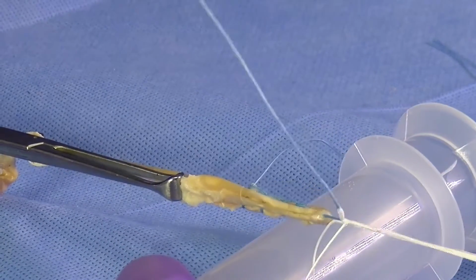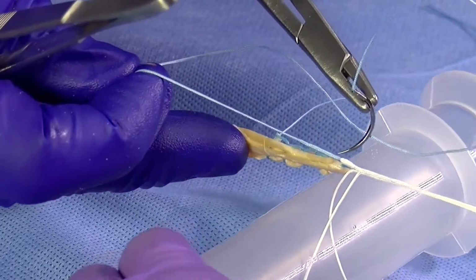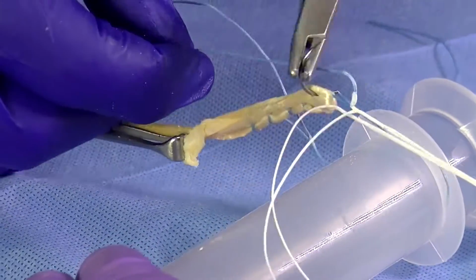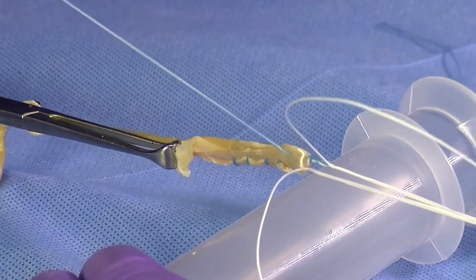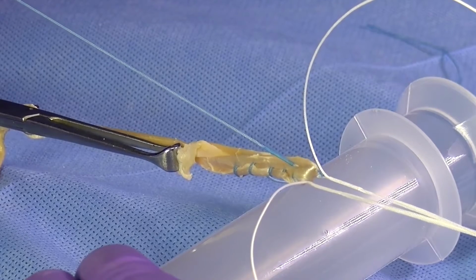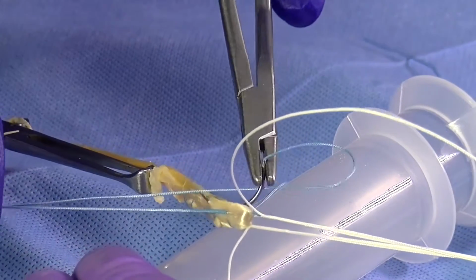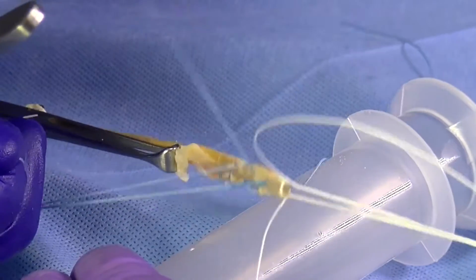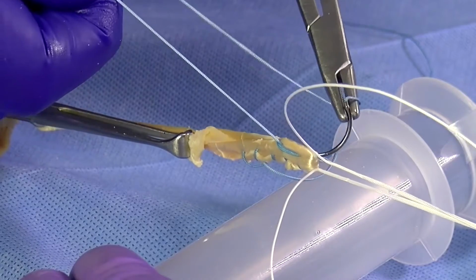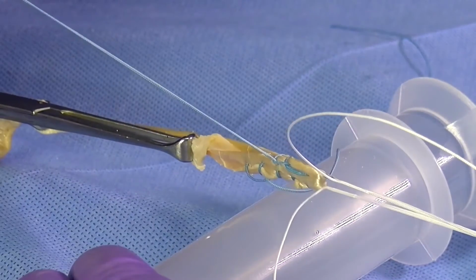So we've got one side secured. Once again, the first throw, that one thing I like to emphasize, particularly on the second stitch, see how I will pull, and I want to seat that saddle. And the key here, I think, is to make sure you get both strands of tendon. I don't mind if the sutures overlap. Once again, that's why we used tapered needles.